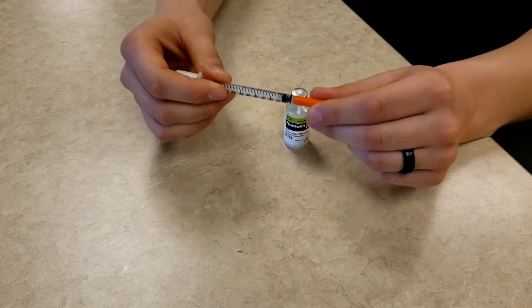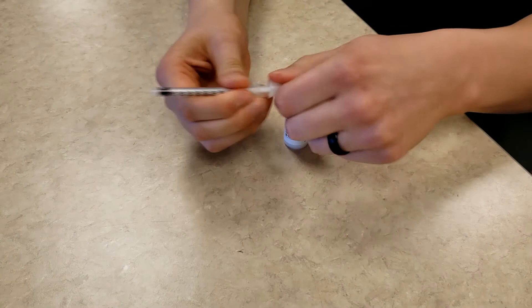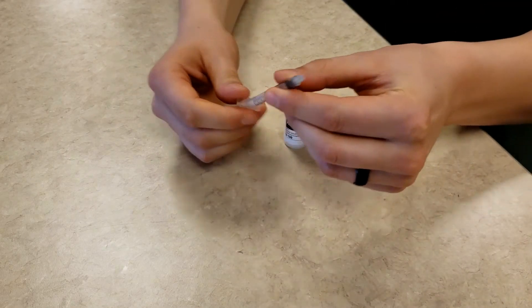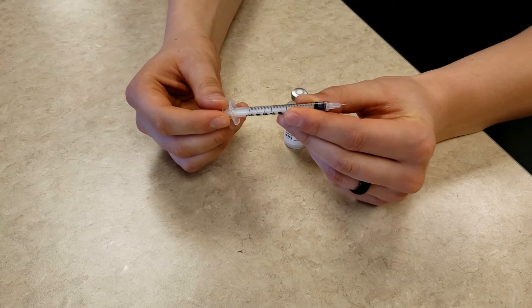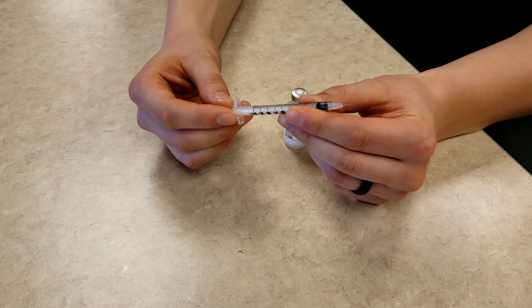Now you can grab your sterile syringe and remove the covers from both ends. The next thing you are going to do is inject air into the bottle of insulin. The amount of air that you inject into the bottle is the same as the dose of insulin you will be taking out of the bottle.